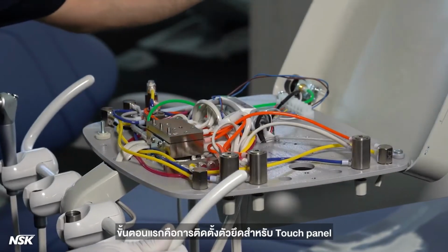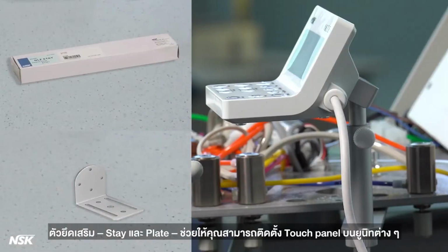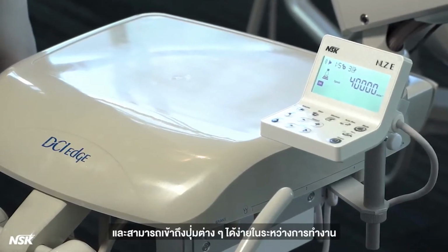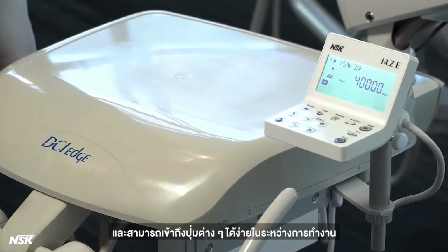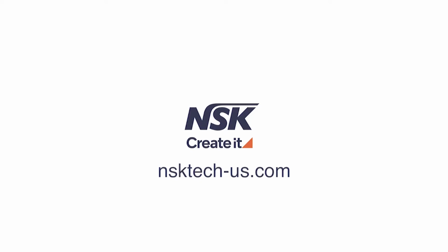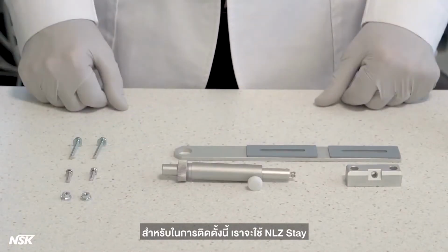Installation. The first step is to mount the bracket for the touch panel. Optional brackets, stay and plate, allow you to install the touch panel on a variety of delivery units in a location where the panel is clearly visible and there is easy access to the buttons during procedures. To see a library of different installations, visit nskTech-us.com. For this installation, we'll be using NLZ Stay.